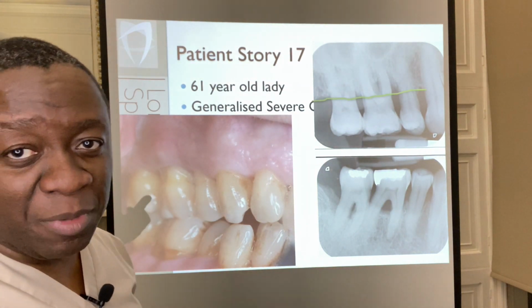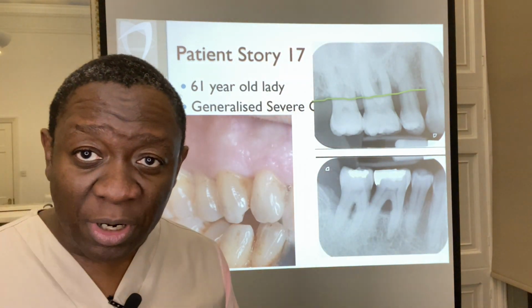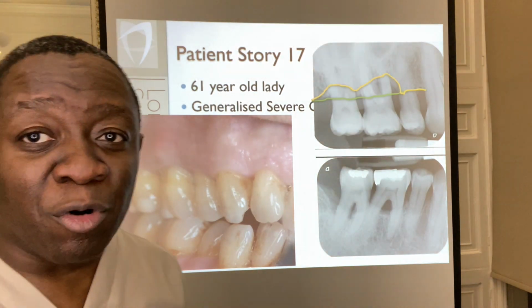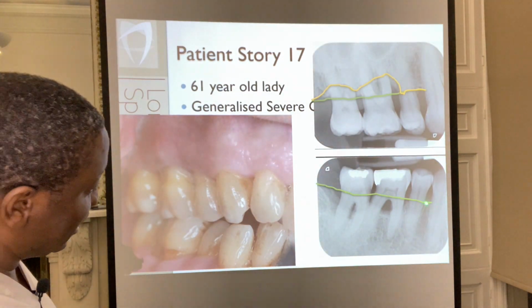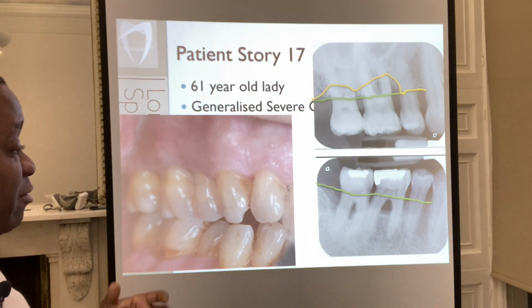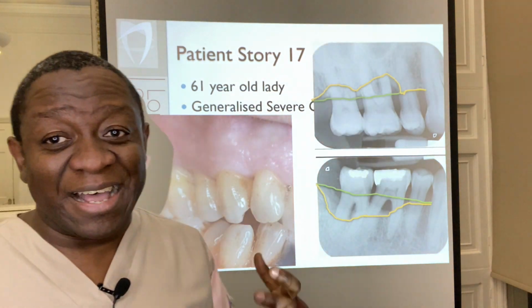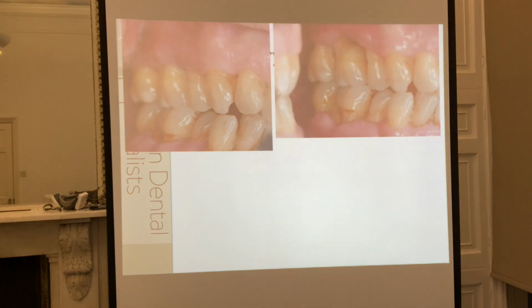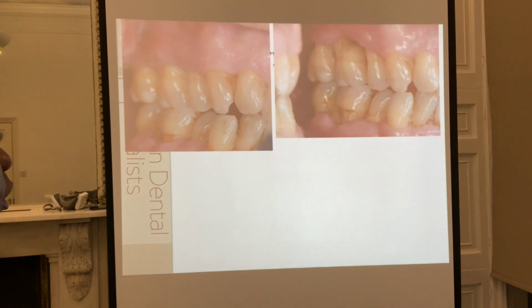And for those of you who've been watching my videos, you'll recall that I always mark the normal bone levels with this green line, and this yellow line indicates how much bone has been lost in the top right side of the mouth. And again, green on the lower right side of the mouth, lower right back teeth, is represented by the green line. That's normal bone, and this is the level of the bone loss that has actually occurred in this lovely patient. So if we look at this patient at the start, and this is exactly what happened at the end.